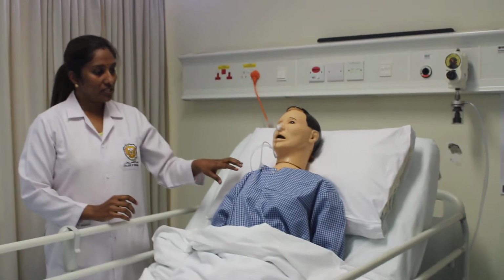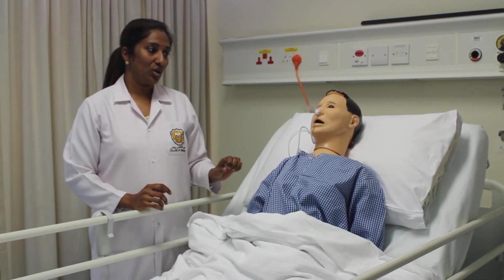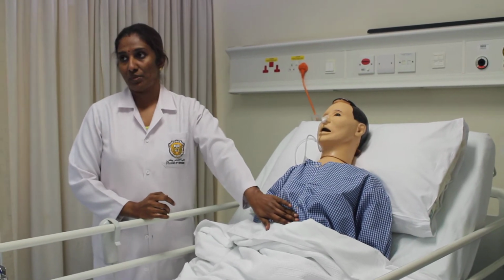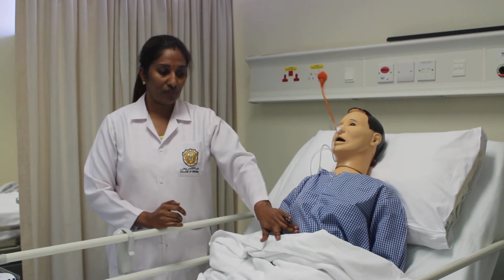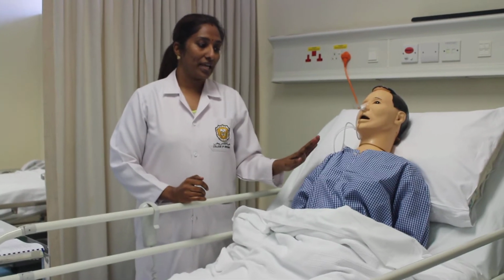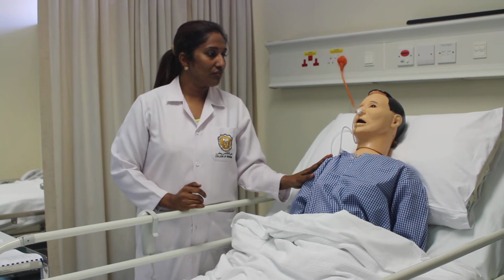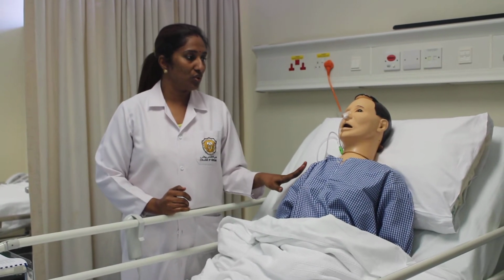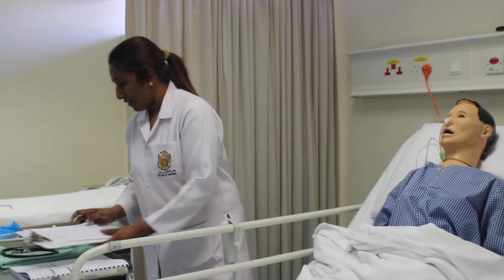I will be just helping you to take out this tube and then you will be able to proceed with your normal diet. Before proceeding with that, I will be doing an assessment for the patient. The assessment very specific to before removal of the NG tube is assessment of the bowel sounds and of any presence of nausea or vomiting in the patient. Let me know, sir, if you feel nauseated or vomiting, because we kept the tube closed for some time. Do you feel anything like that? No. Okay, good.